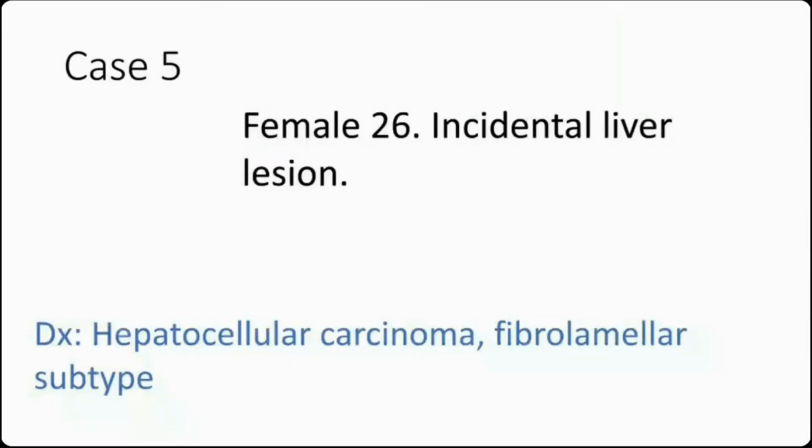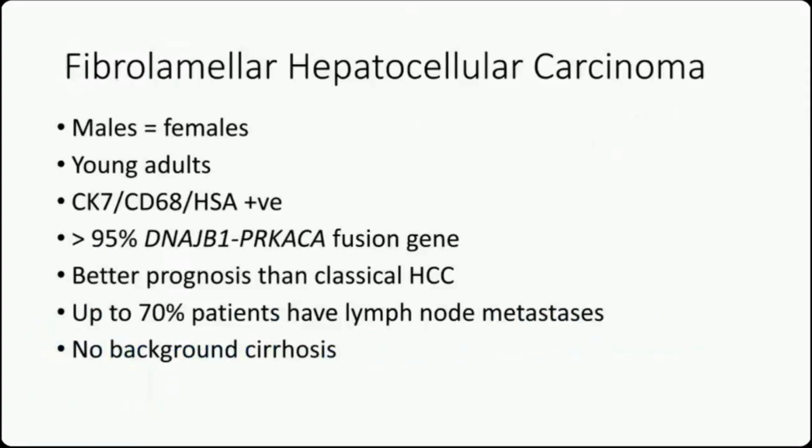And that's a very different kettle of fish from a standard hepatocellular carcinoma. They occur in men and women equally. Very rare over the age of 50, and it's usually teenagers and young adults. They classically stain for CK7, CD68, macrophage marker, and hepatocyte-specific antigen, arginase, HepPar1.